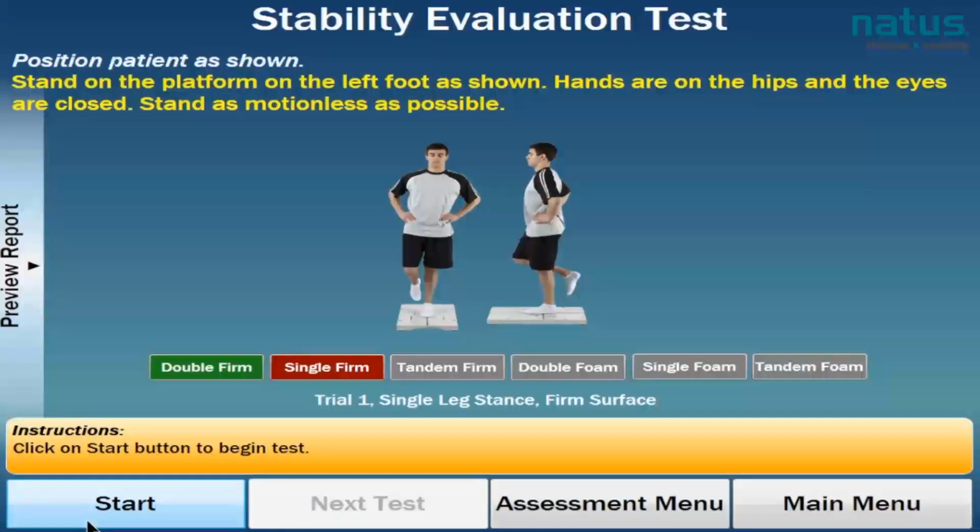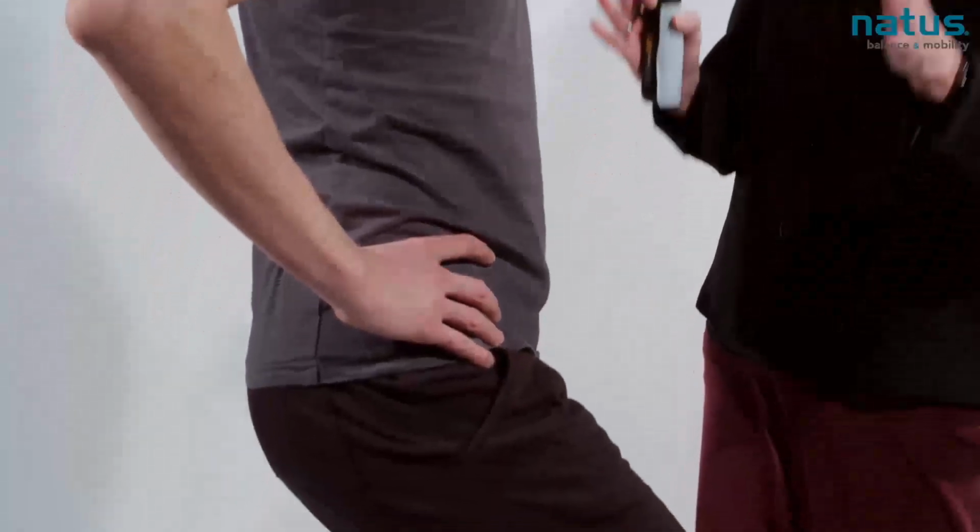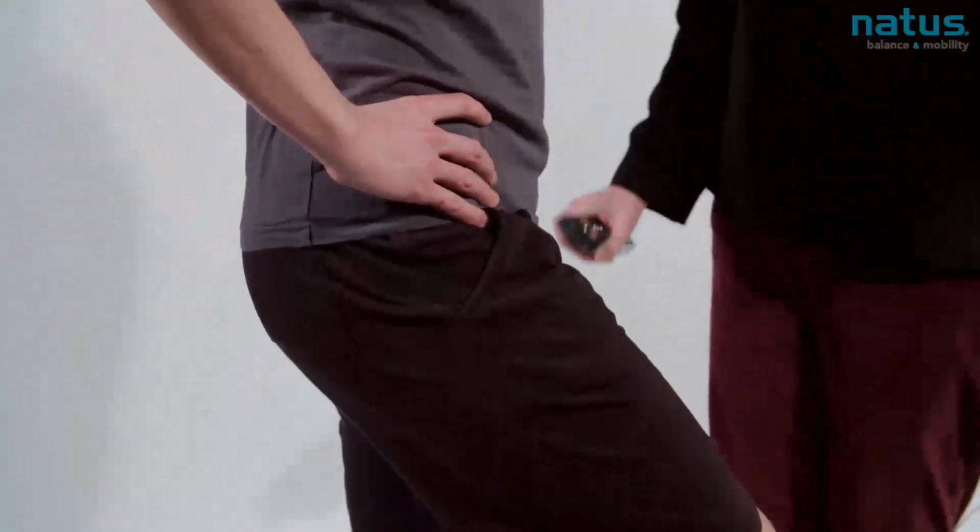The next condition is single limb stance with eyes closed. This is a task that is very challenging. Most people don't practice standing on one foot with their eyes closed. It's a new task. So before we test, we want to give our patient an opportunity to practice. So I'm going to have you stand on your left foot and balance with your hands on your hips. Good. When you're ready, close your eyes and this is just for practice.